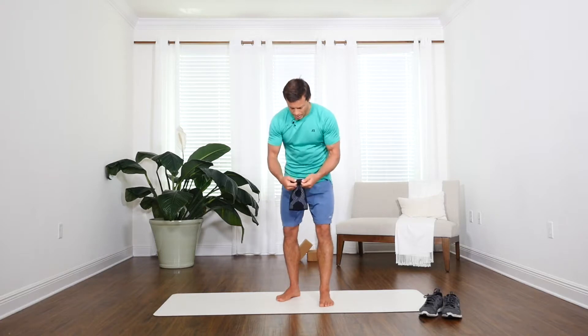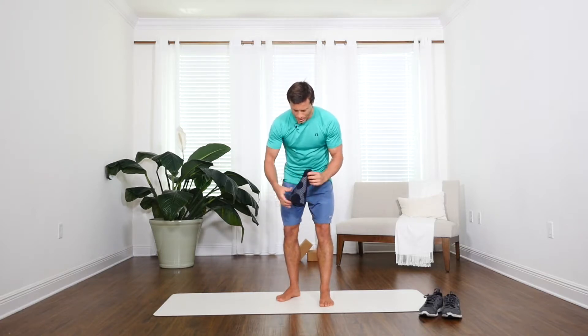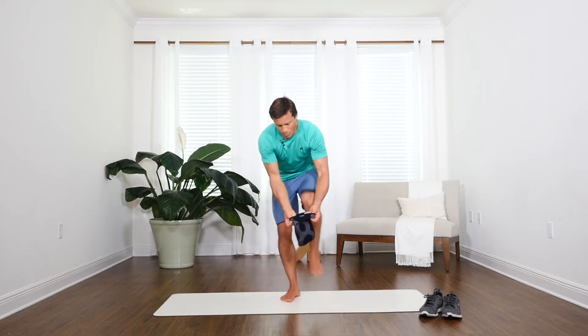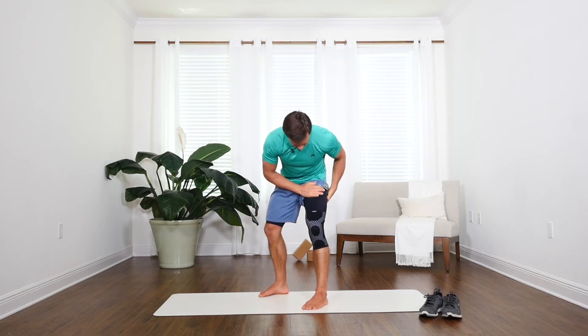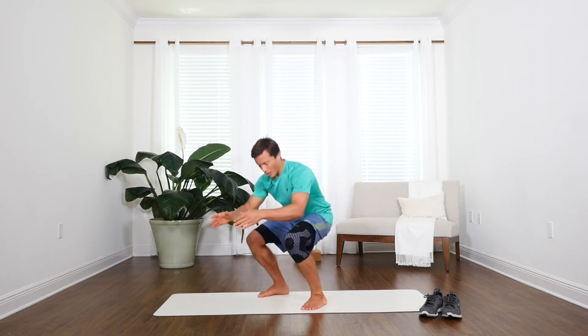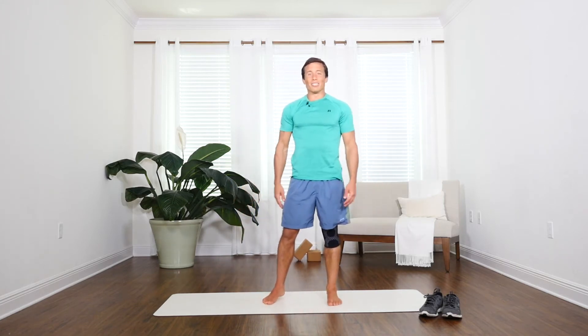It's got this really nice rubberized grip around the top of it to help keep it in place. It's made of this breathable fabric and it goes on pretty easy. Just slip it in and I know it's going to stay in place even when I have these slick guys on. It grips to it and stays in place while I move, helping support the knee and increase the circulation so that I can do more.